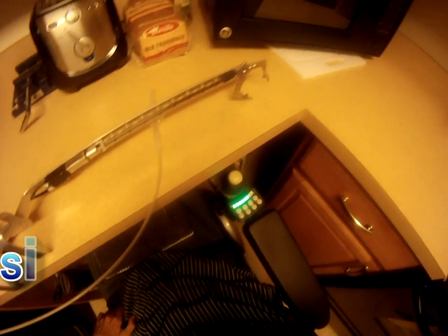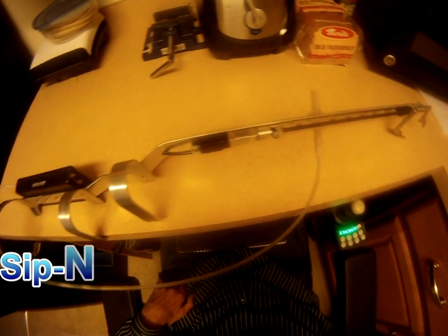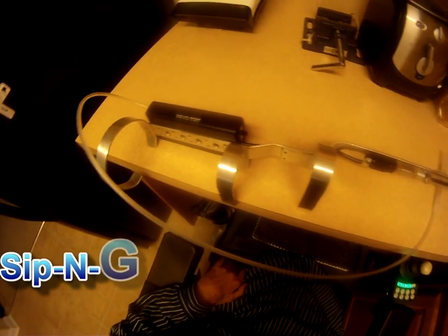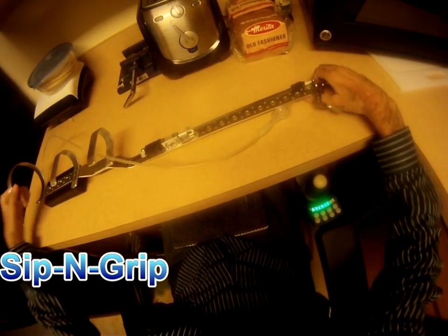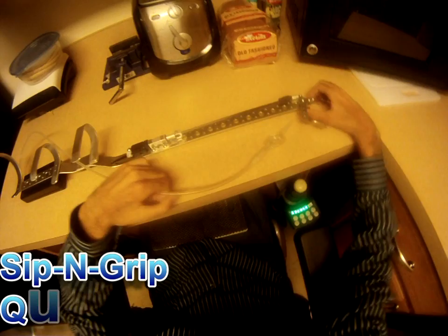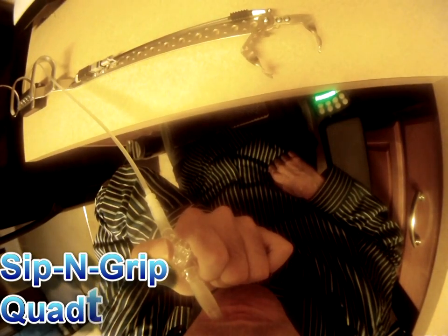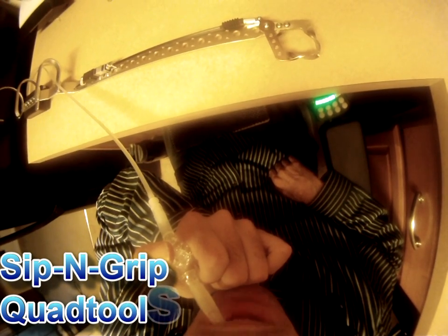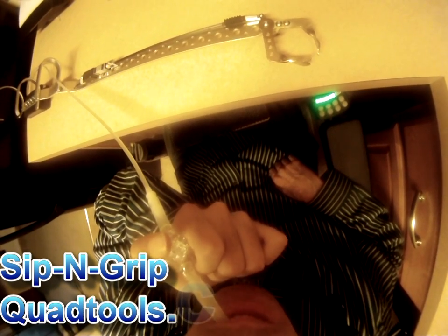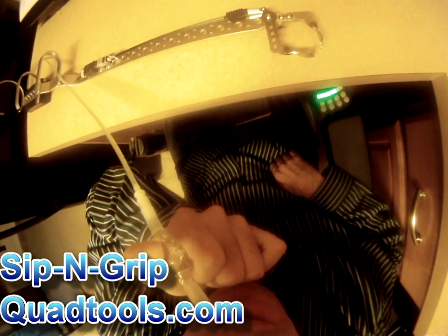Introducing the Sip and Grip — the world's first sip and puff actuated reacher, designed for quadriplegics by QuadTools.com. This reacher was mainly designed for those without the ability to curl their wrist back, or with really weak wrist muscles that are unable to use the current reacher on the market. With the slightest sip and puff into the tube, the jaws open and close on demand, with up to 10 pounds of force in the grip.